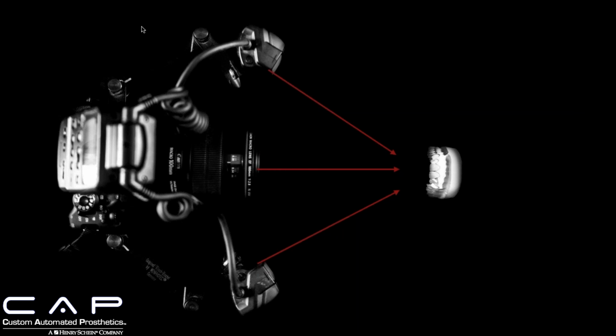It's a fixed flash bracket, so you don't have to worry about repositioning your flash for every photo, because after a while the joints on these brackets do wear out, and so if you bend over too far, then your flashes will slouch and move around.